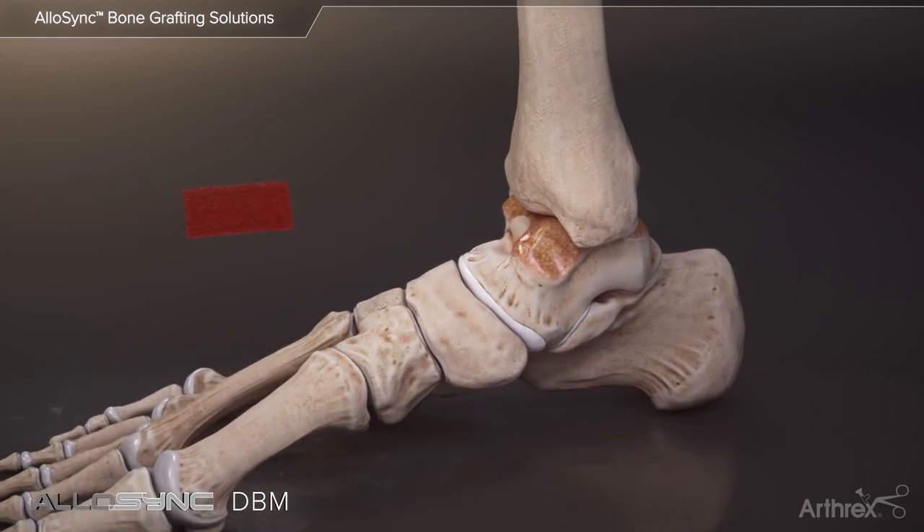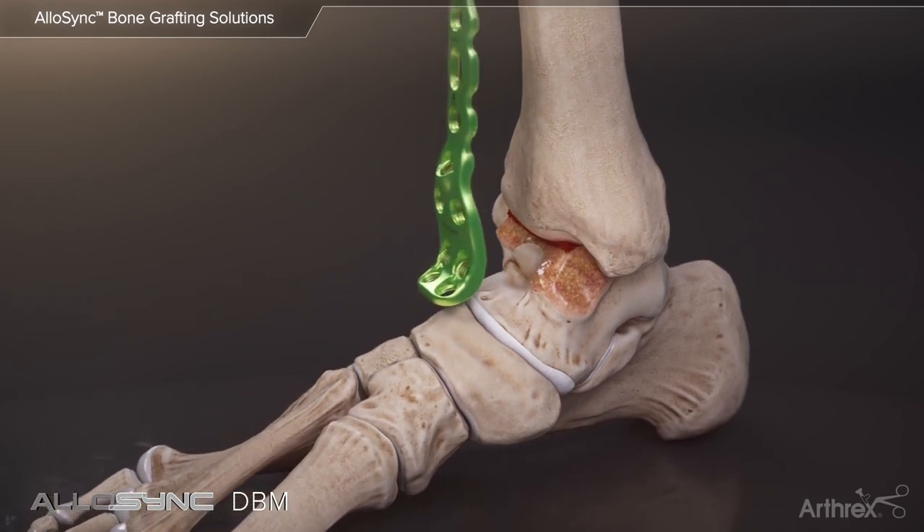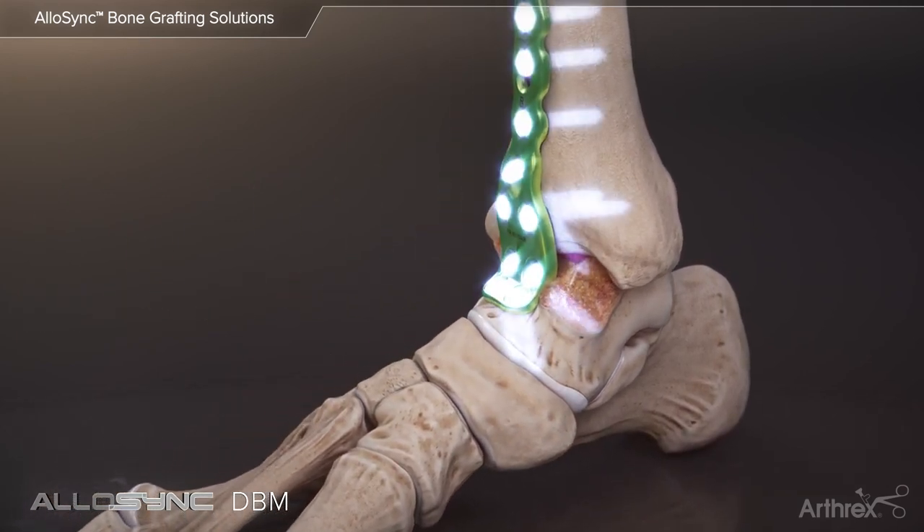For fusion cases such as an ankle arthrodesis, Allosync demineralized sponges soaked in BMA can be placed at the fusion site for maximum biologic healing.